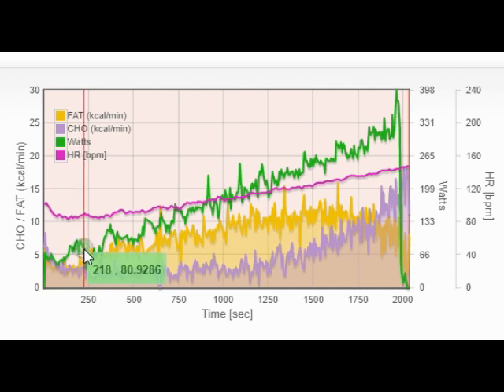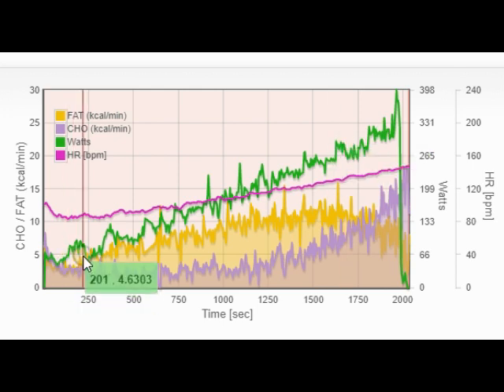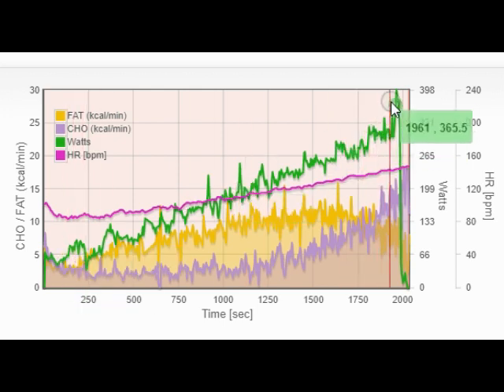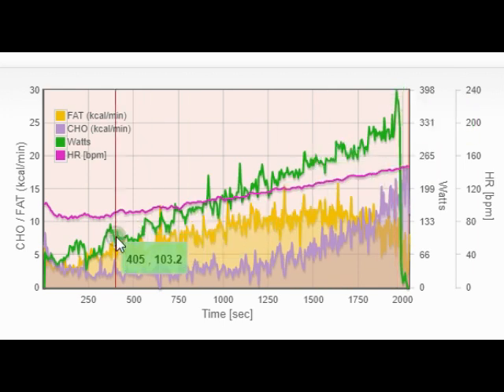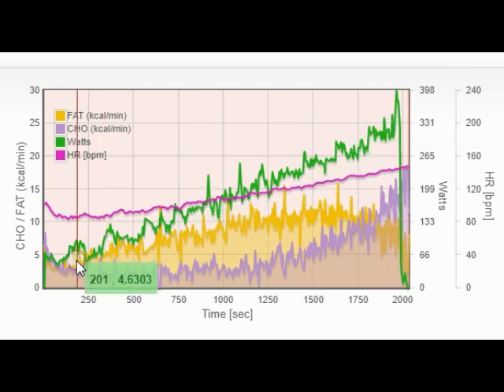In my case, I started at 50 watts, went up 25 watts every 3 minutes. I pushed a little extra to the last stage and averaged 312 watts. So I went through everything from 50 watts to 312, and I peaked out right at 400 watts. So that's my stress. That's my life. That's my performance event. That's what's coming at me that I have to perform.